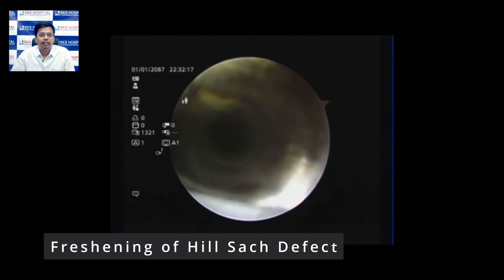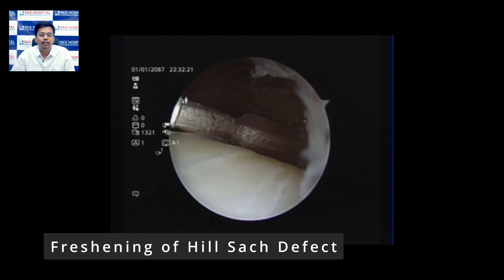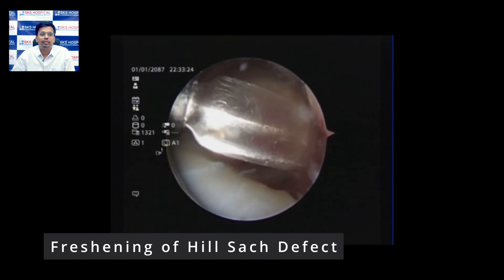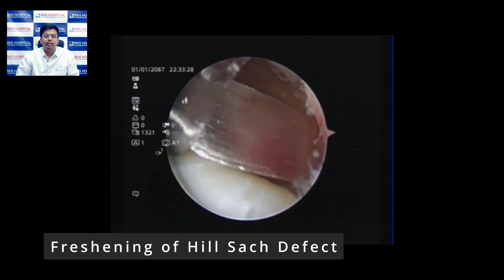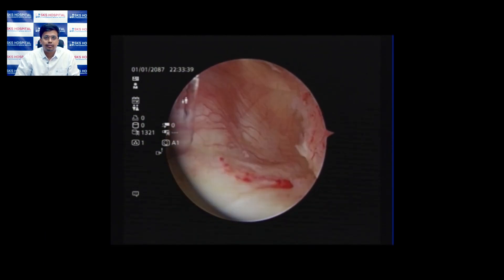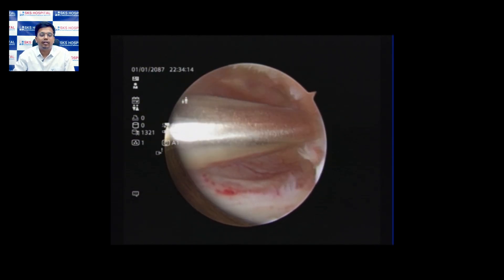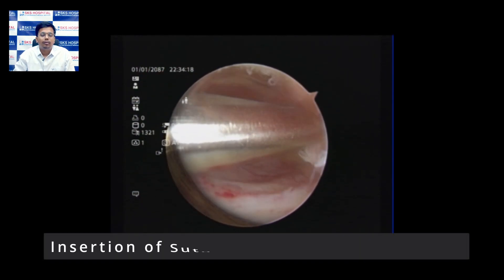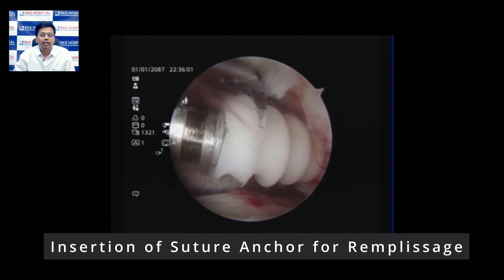We begin by freshening the posterior superior surface of the humeral head where the Hill-Sachs defect is located. Once the raw bone is exposed, punctate bleeding is seen, which indicates that the raw bone has been properly exposed. We then place the awl at the first point of contact on the posterior superior surface of the humeral head within the Hill-Sachs defect.